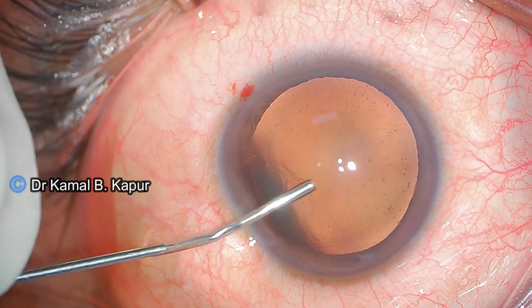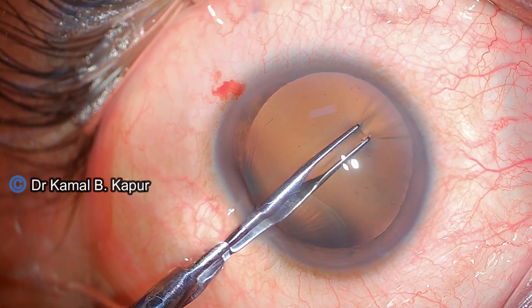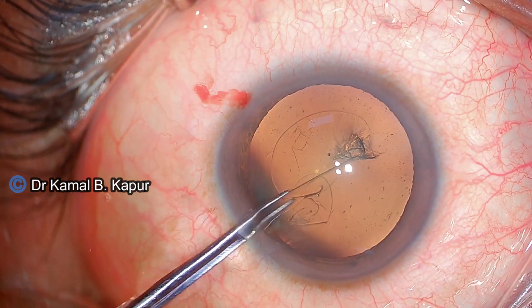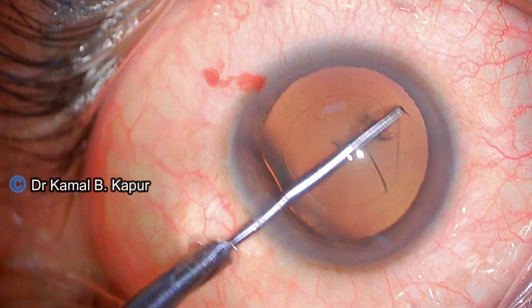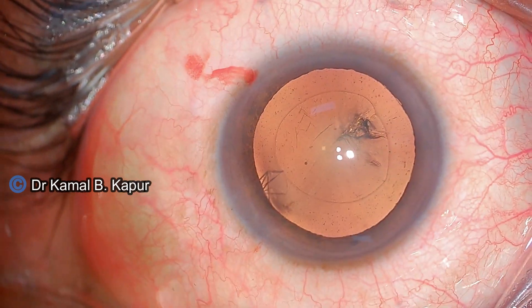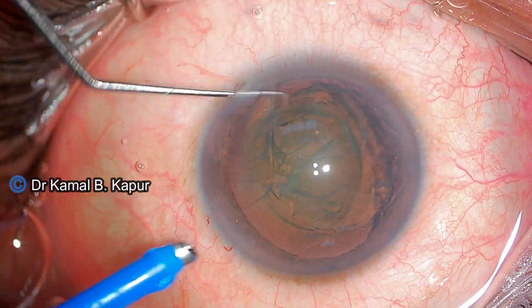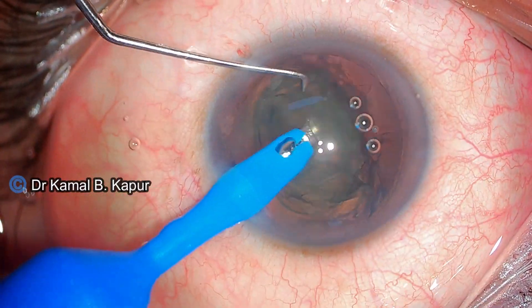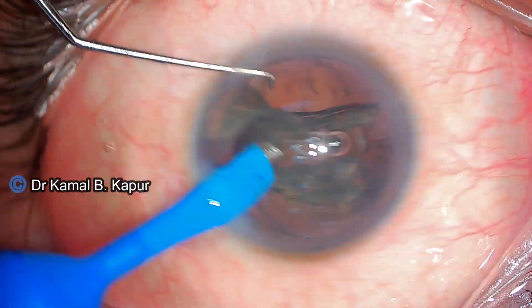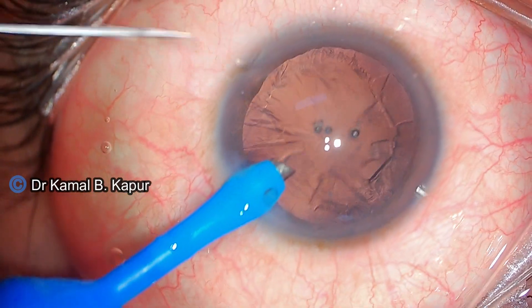We start by removing the crystalline lens. In this particular case, this gives us a wider anterior chamber and also good visibility of the angle and its structures. We will fast forward the steps of the lens removal as it is not of much relevance here; it is more important to see the steps of the BANG technique.